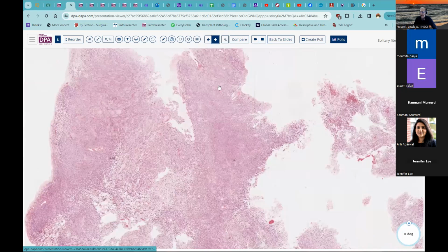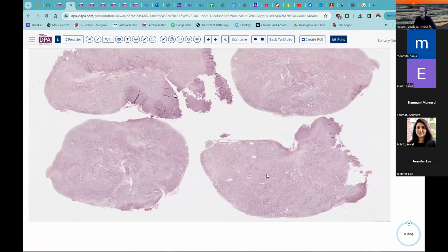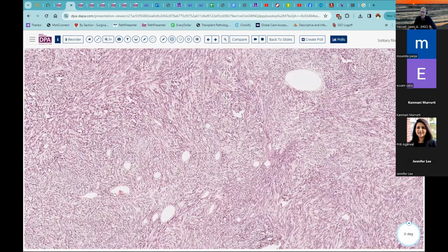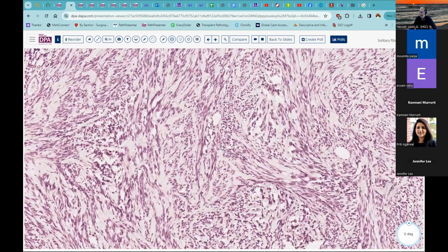Now, I'm sure you recognize that the defining features for solitary fibrous tumor today are based largely on the fusion gene presence of a distinctive protein that is not normally expressed in most other soft tissue tumors, and certainly not in most other spindle-shaped tumors, and that is the STAT6 marker. We have various fusion partners with the STAT6 gene, but the end result is that marker is expressed to a much higher and greater degree than in virtually any other tumor.